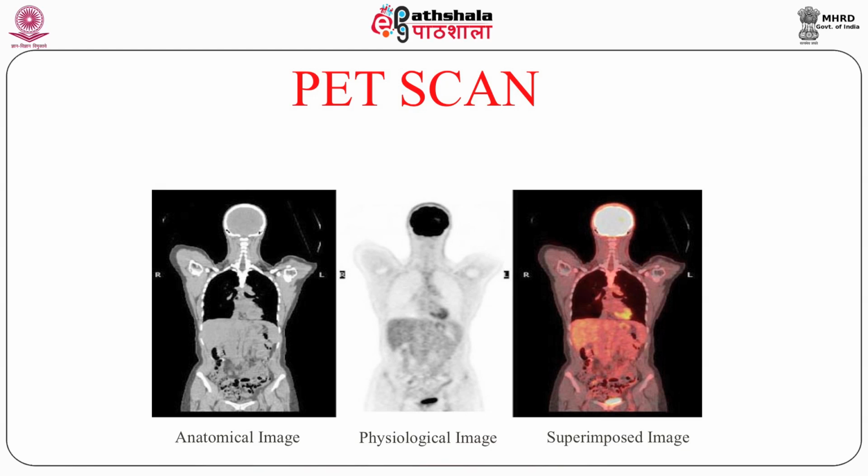It has come from the unit which is attached with PET. Physiological image you are getting from the PET. Now, what exactly happened? The quality of image if you see from the CT part or MRI part is very good. You can resolve, you see the resolution, but the same quality or clarity of the image is not there when you take the scan from the PET.